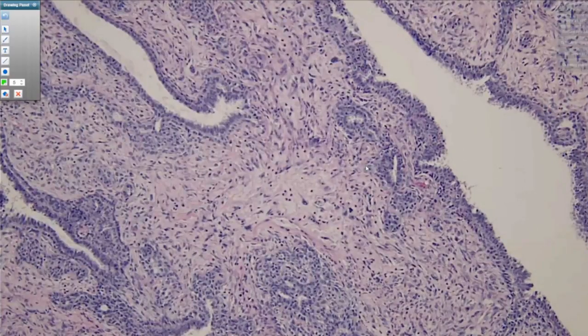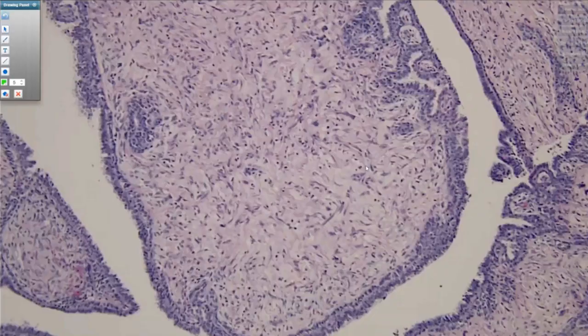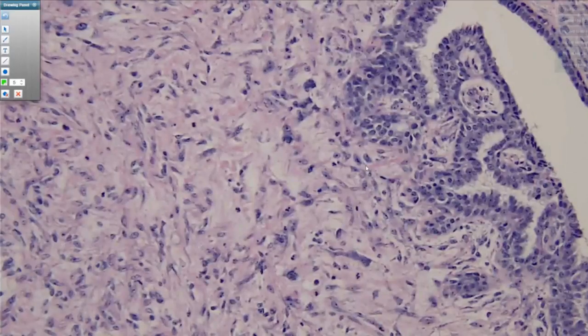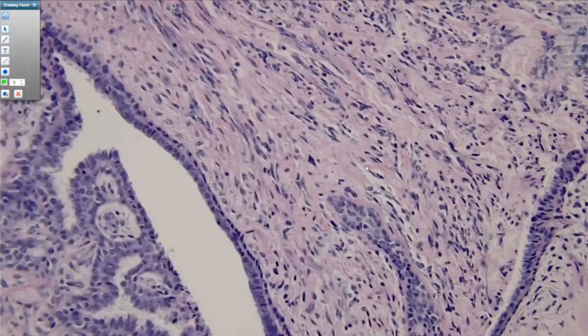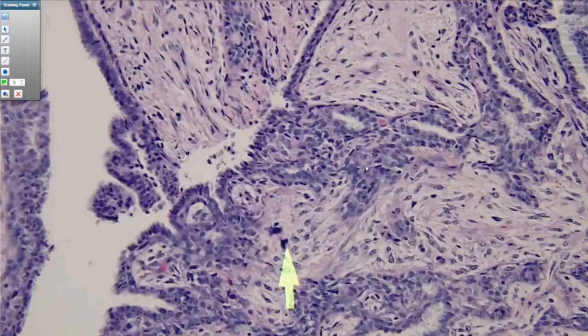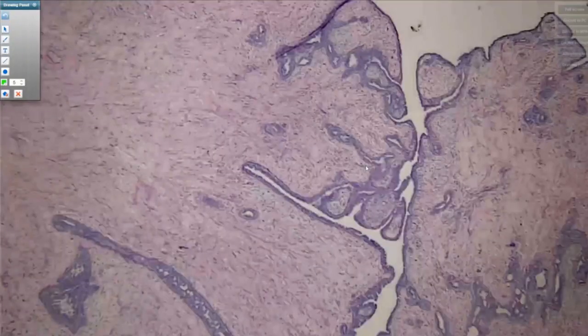The differential of benign phyllodes is a fibroadenoma. So those are rarely coming into consideration when we're talking about a purely spindle cell lesion of the breast, because they commonly have the epithelial component. On the other end of the spectrum, we have malignant phyllodes tumors, as in the one seen here. We see marked cytologic atypia in the stromal cells, frequent mitotic activity with atypical mitoses, and variation in the stromal cellularity from less cellular to more cellular.